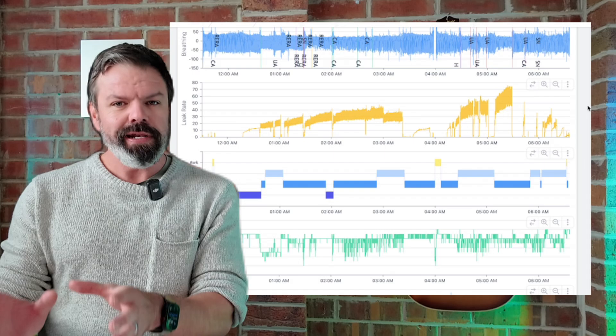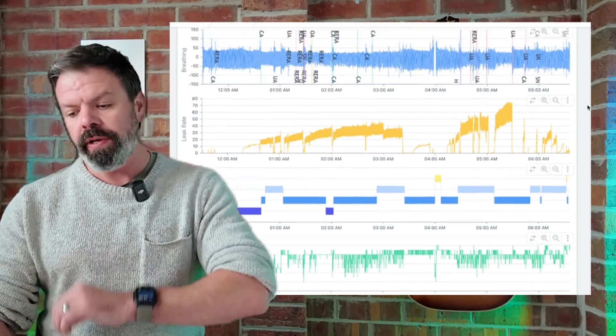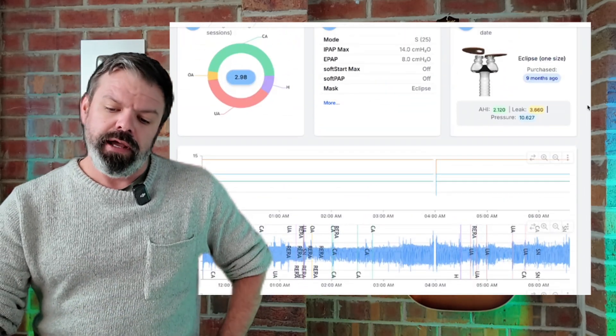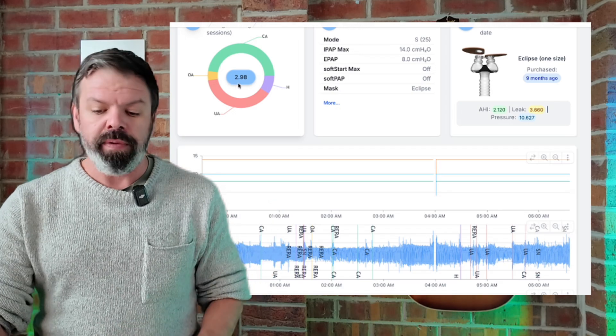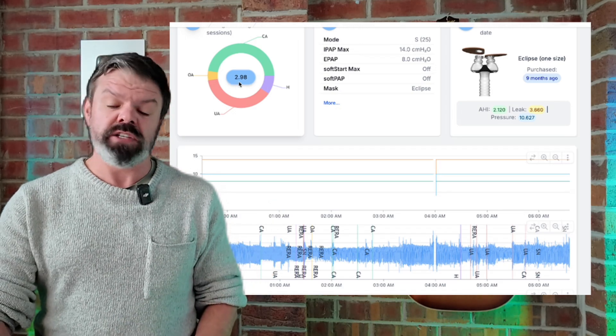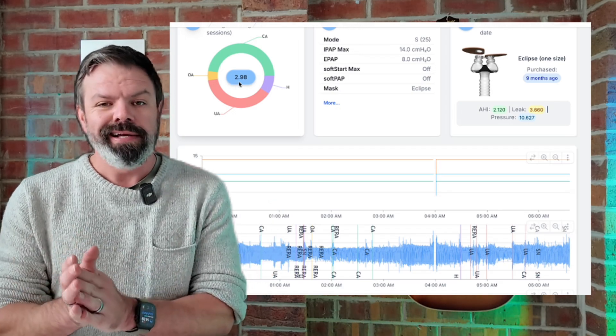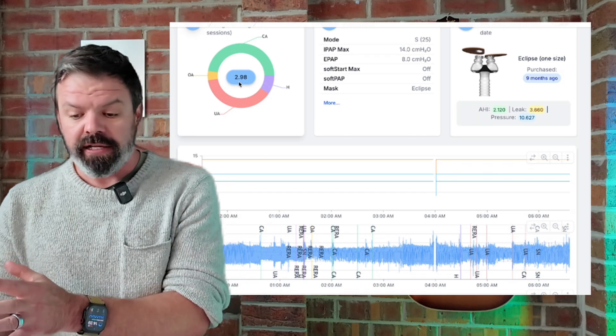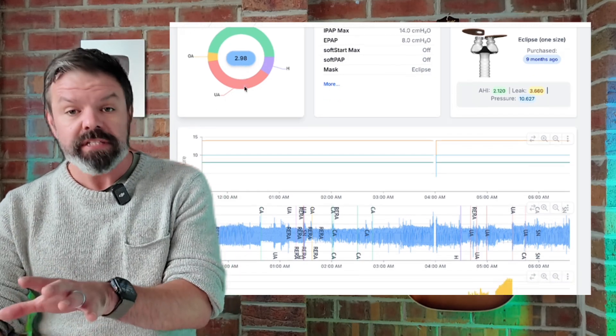So you really need to monitor it yourself, because if you go in to see a clinician and they go, hey, you're doing great, your apnea-hypopnea index is only 2.98, well done - that doesn't accurately reflect the quality of sleep.